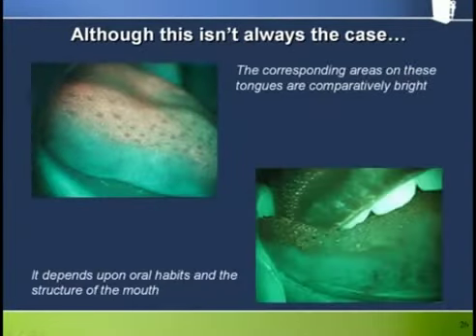Of course, everybody's different, and what we've just seen isn't always the case. The corresponding areas on these tongues are comparatively bright. The appearance of the tongue will depend on oral habits and the structure of the mouth.